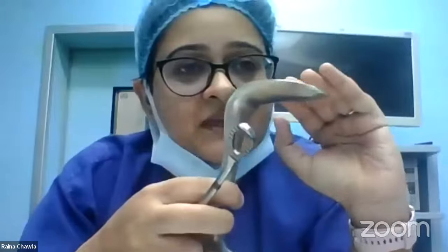So it can be directly introduced in the vagina. Some people prefer to introduce it like this and then turn it around. So introduce it along the longitudinal axis and then turn it around, so that it causes less discomfort to the patient.